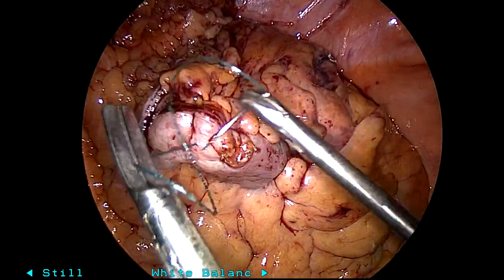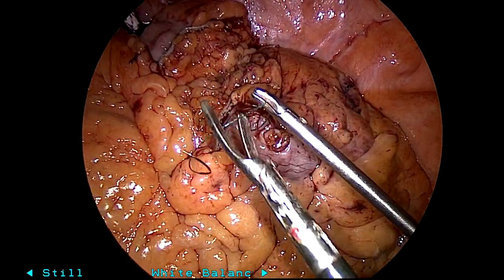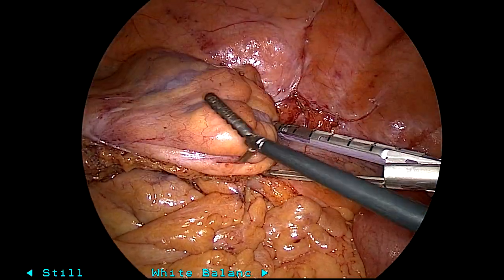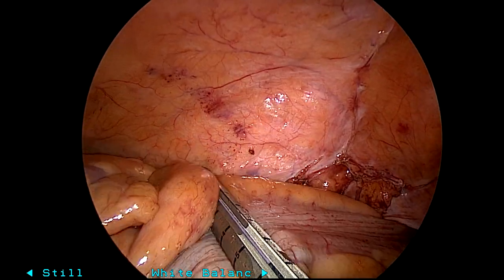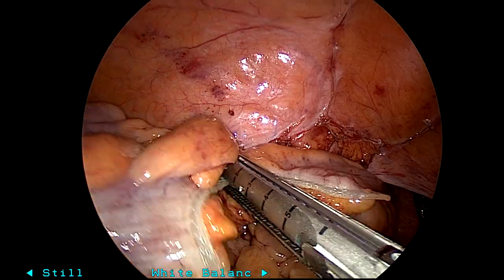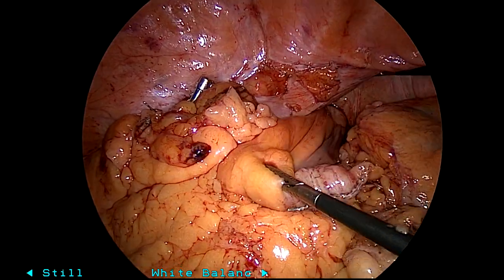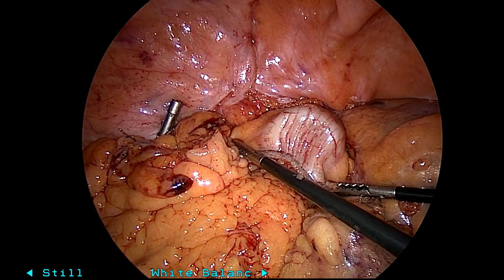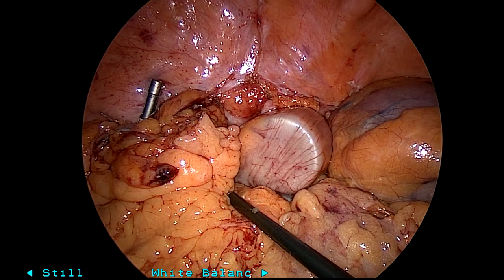Prior to doing sewn anastomosis, this was almost exclusively my method of anastomosis when I use the stapler more frequently. Now we'll go ahead and staple distally — you can clearly see the color change there. Then we'll go ahead and place the EEA transanally. I don't like crossing staple lines, so I'm showing how I'm going to pull that anterior staple line posteriorly and then bring the spike out.